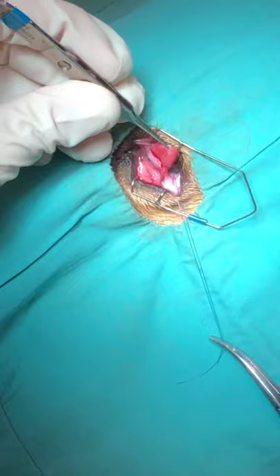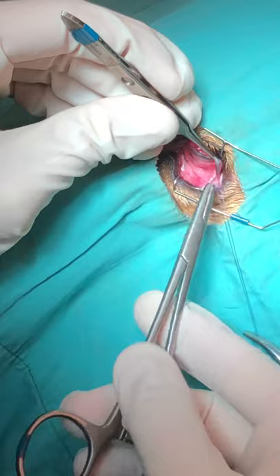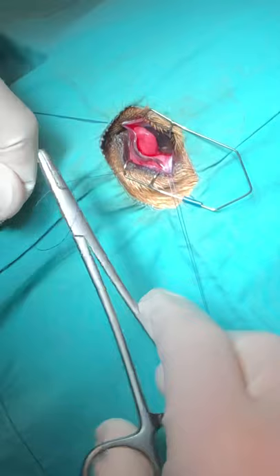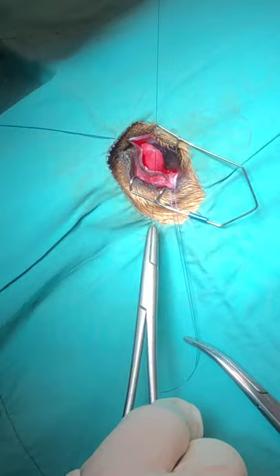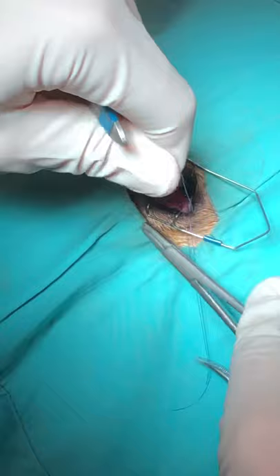Before making the incision on the bulbar side, go ahead and tie a knot. We're using 5-0 monofilament — you will see it described where people use braided suture as well, but I prefer monofilament for knot security. You want to tie your knots on the palpebral side of the gland so your knots don't rub. A common complication of this procedure is ulceration if the knots are tied on the bulbar side and they rub, so you want to avoid that.